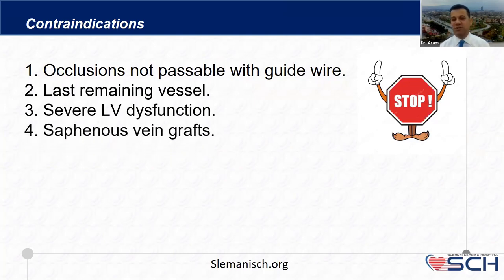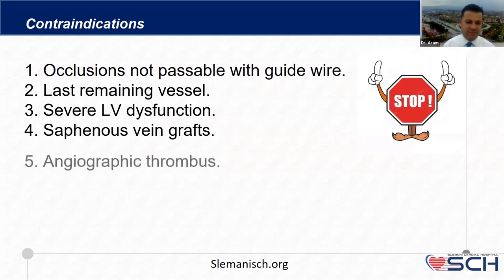If you have an SVG, you know that after a few years there will be a lot of degeneration, and if we do rotablation, it may definitely cause no-reflow. However, there is some literature talking about case studies where they did rotablation for SVGs, but I think the size of the burr was so small relative to the size of the grafted vein.